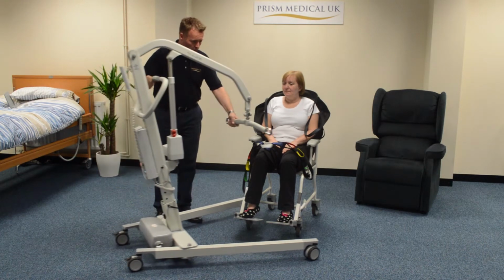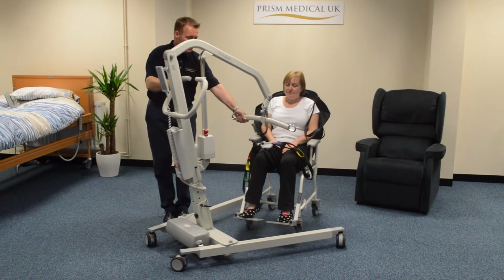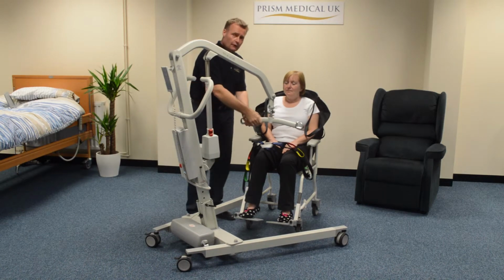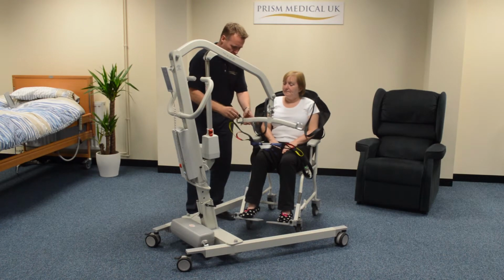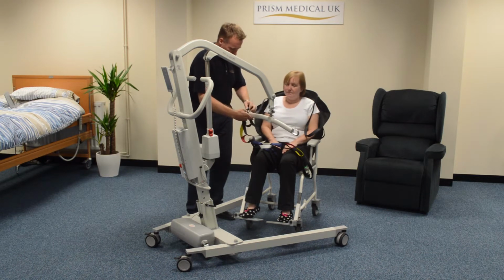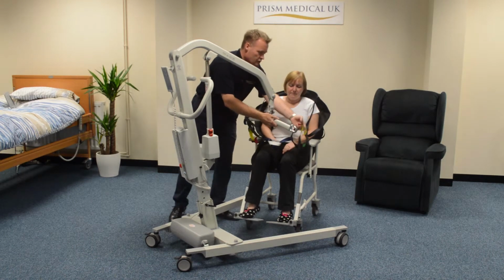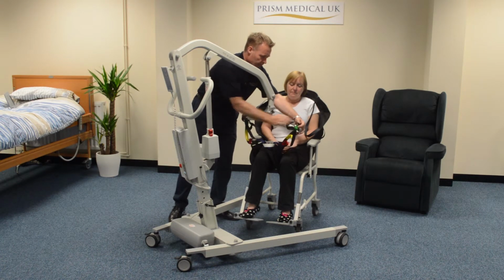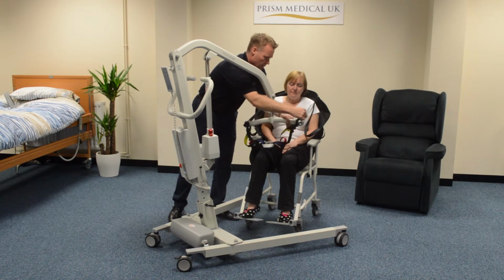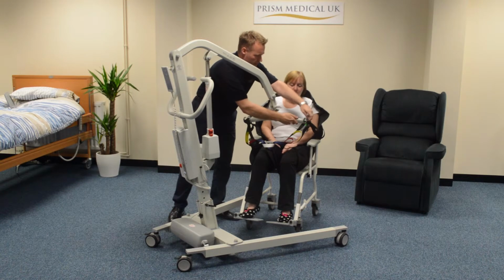Once we open the legs, we can bring the carry bar in. Quite important to keep your hand on the carry bar at all times to ensure that the client doesn't lash out and cause any damage. So we'll start, we'll put the leg sections on first, and then the shoulder strap, leg section from the other side, in the same colour, and the shoulder strap again.